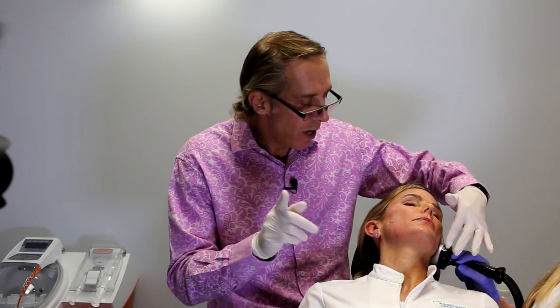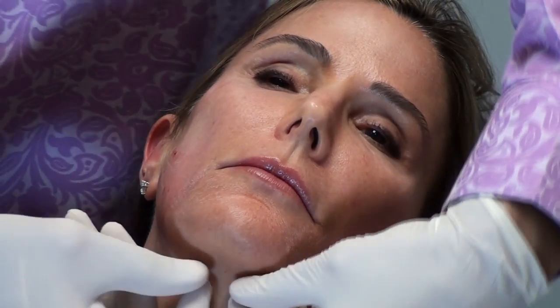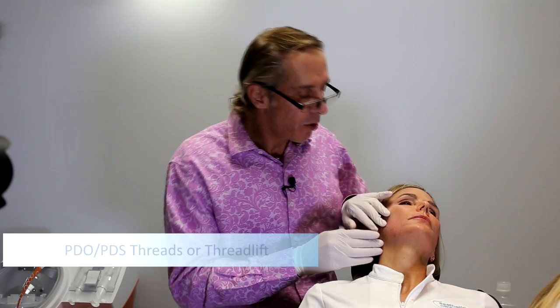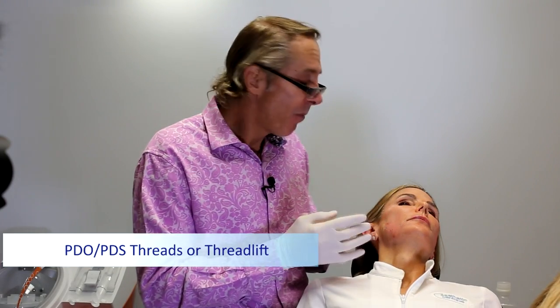So there's also one other suture I didn't talk about. It's called a double barb suture, and it has 2 barbs on it. And that's for using it in the midline to tighten a little tighter, or if you want to use it in the cheek, and it gives kind of a bunching of the cheek to give you a little enhancement of the cheek as well as tightening. So that's called the double barb suture. So that's PDO threads. It's also called a thread lift.